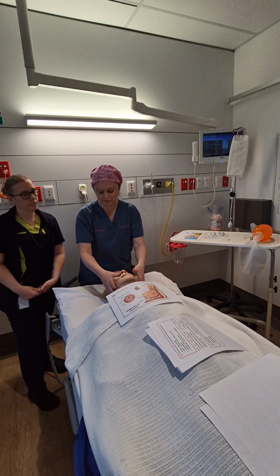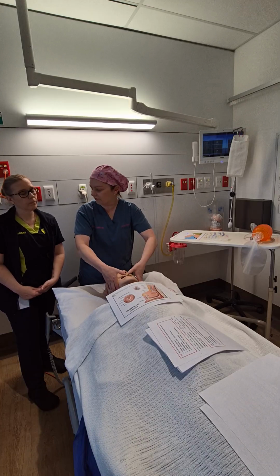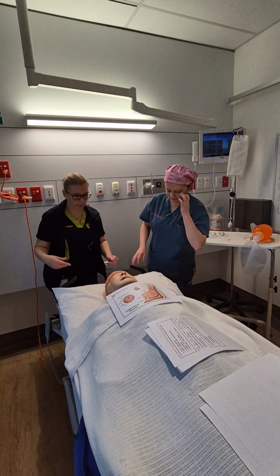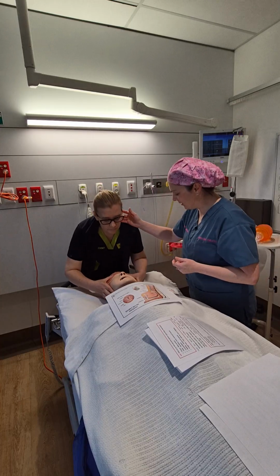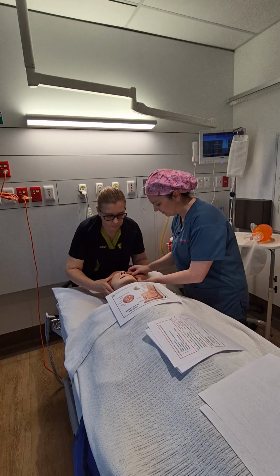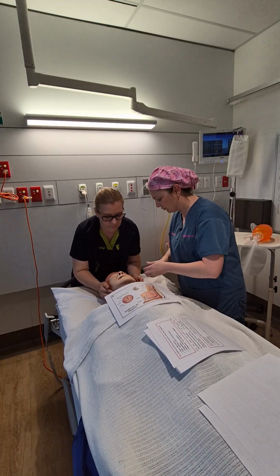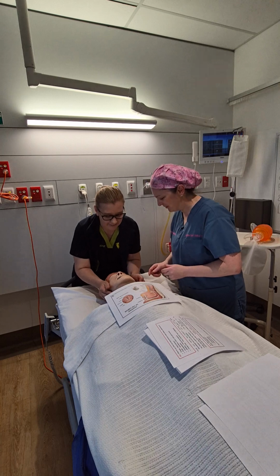We have these thumbs free, so if we're helping with the airway at all, we can open the jaw, or we can hold a face mask on the top. So I'll just get you to give that a go if that's okay. So the 2 fingers, angle of the jaw. You're aiming for here. Wonderful. Oh no, thumbs go there. Thumbs. Wonderful. Excellent. And then push that jaw forward. It's a bit tricky, isn't it? But no, good job. Nice work.